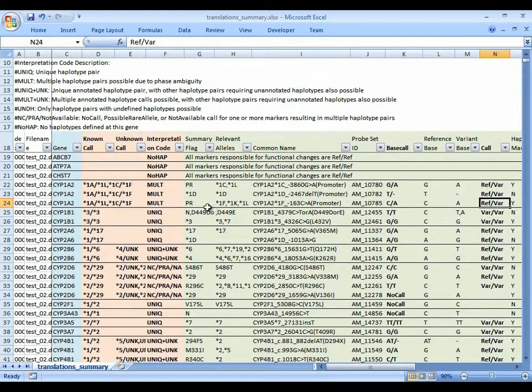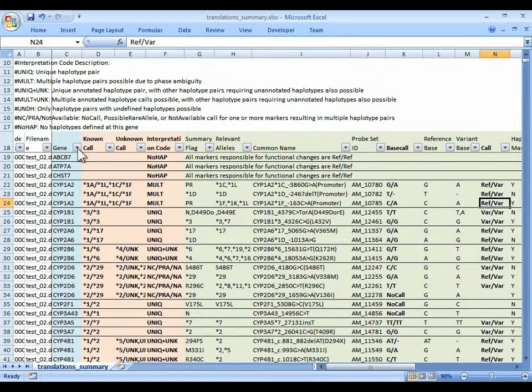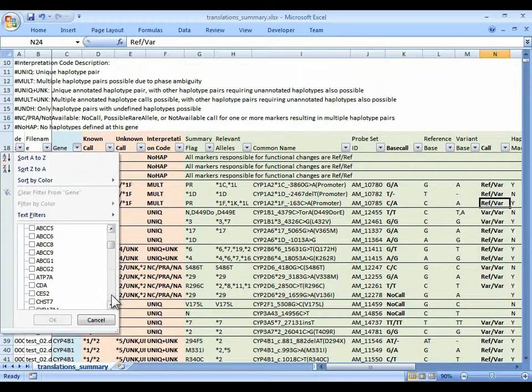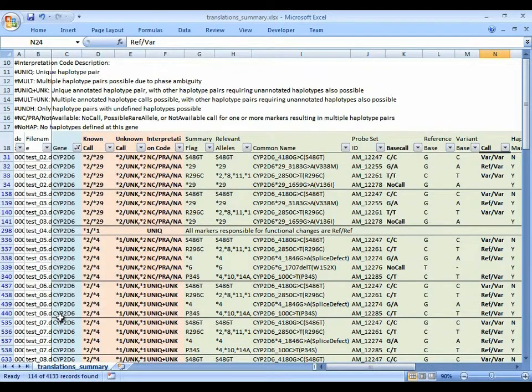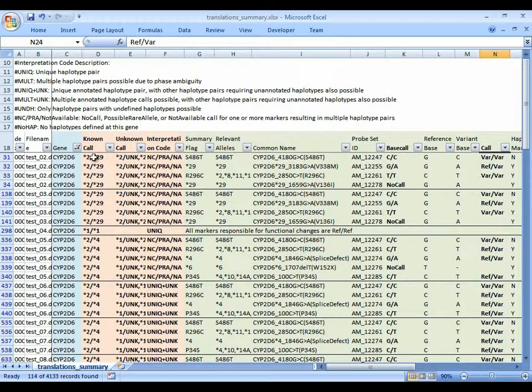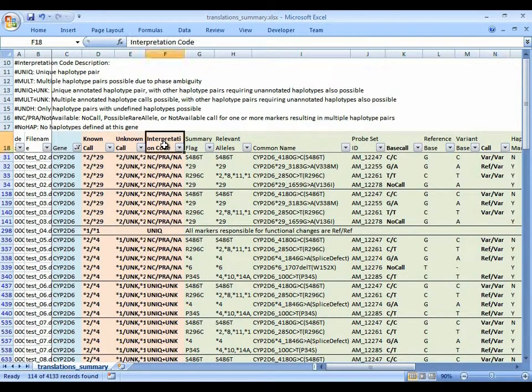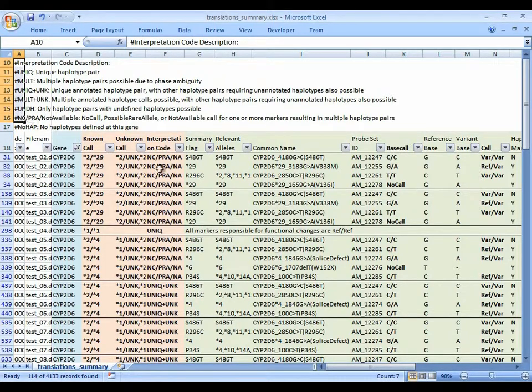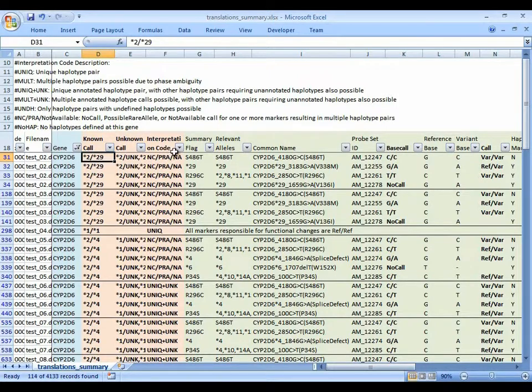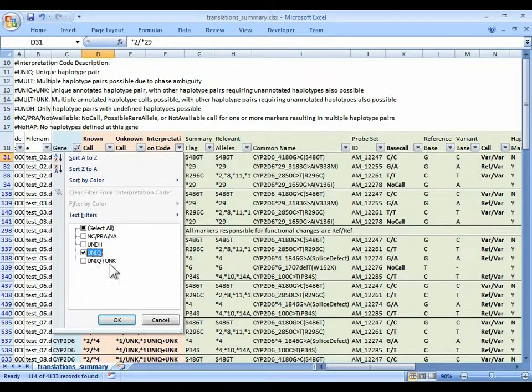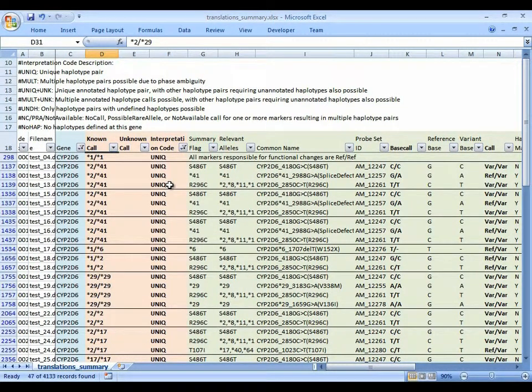So let's look at this for a particular gene. We have, let's filter on, let's say, CYP2D6. And let's filter this out even more. So within this, on the haplotypes, we have different interpretation codes. The interpretation codes are listed in the header of what they mean. They're basically a way of annotating what the known call is. Let's start with the most straightforward interpretation code, unique, in which samples have that code.